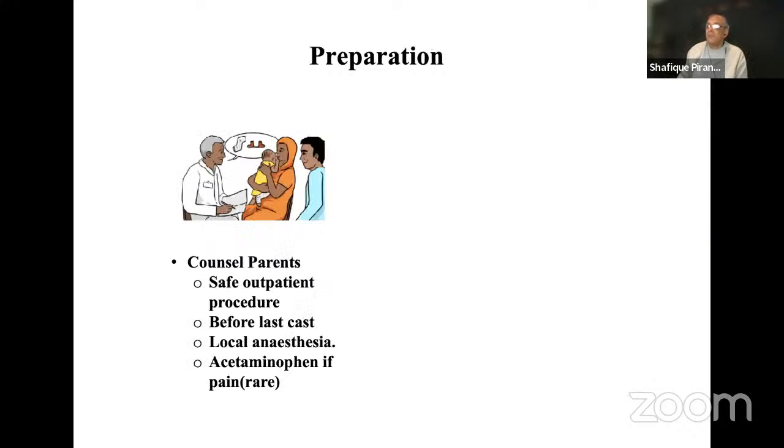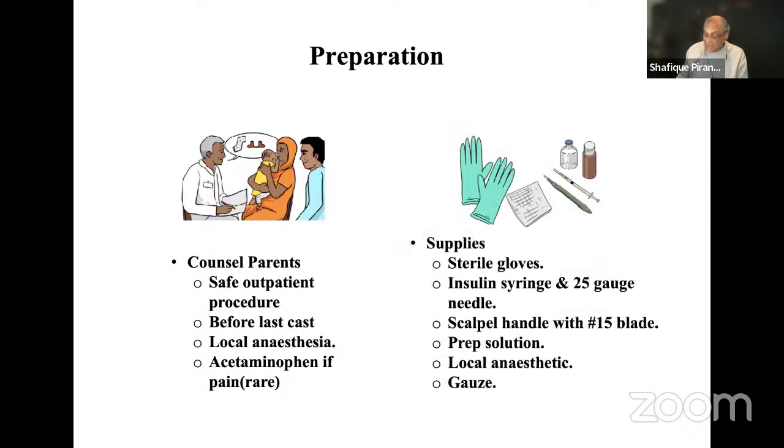So how do we prepare? We counsel the parents. We explain it's a safe outpatient procedure. It's done before the last cast under local anesthetic. You don't need a general anesthetic. In fact, general anesthetic is dangerous in these babies.